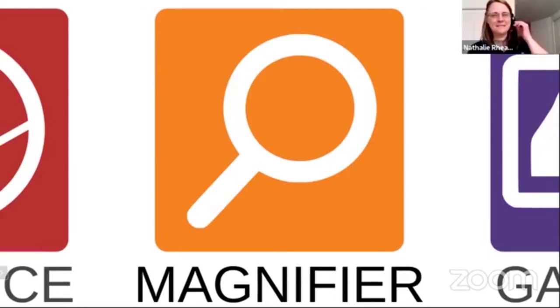Thank you very much. My name is Nathalie. I'm the product manager for low vision products at HumanWare. Today I'm going to introduce you to new features that are going to be launched and available tomorrow on Prodigi 4.3.0. As Eric told you, this is the software used in the Connect 12 and the Reveal 16i. I'm going to talk a little bit about the product as well, because we have some newcomers, but I want to go quick on it and show you the great new features. The first one, the one I love, is the book share options.